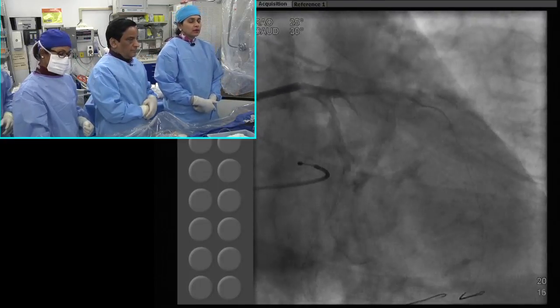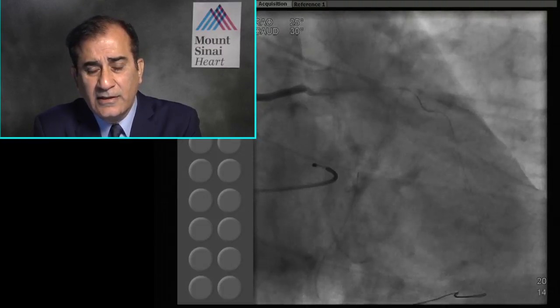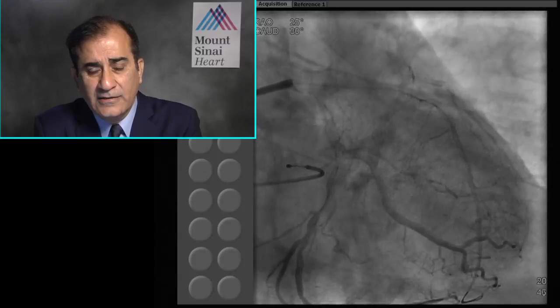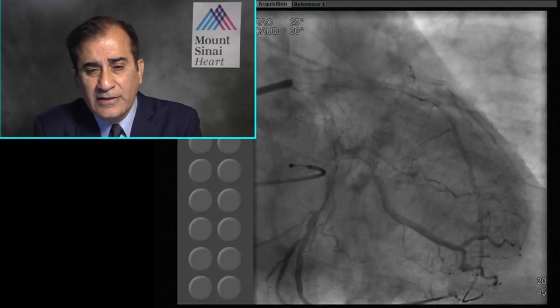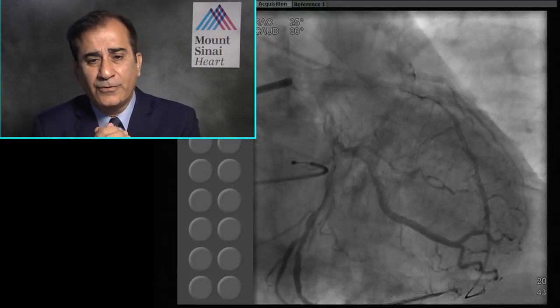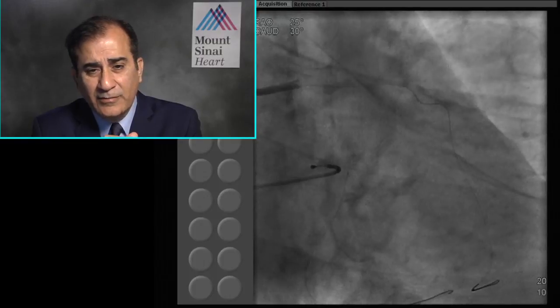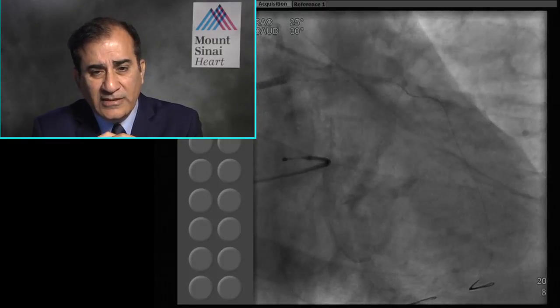Samin, a couple of questions about your very elegant presentation, which has become so pertinent considering the events about the approval of the BVS which are going to be happening. You mentioned the 4 recommended steps for BVS. That's exactly what you do for most of your complex lesions, no?